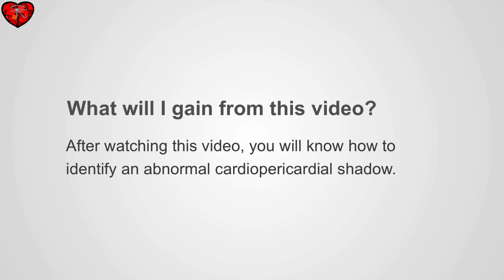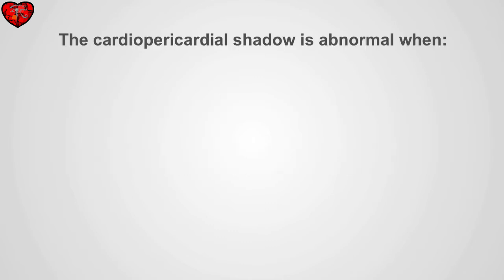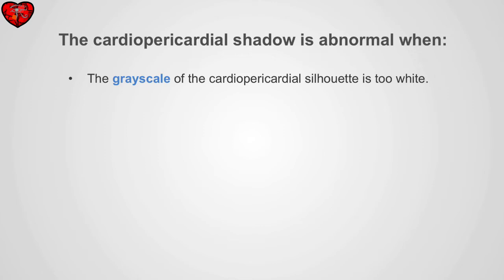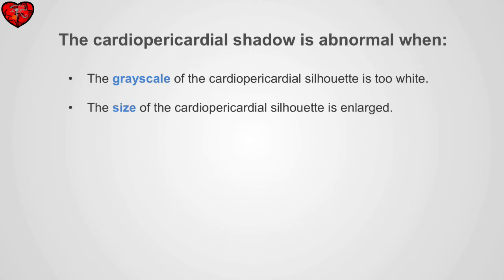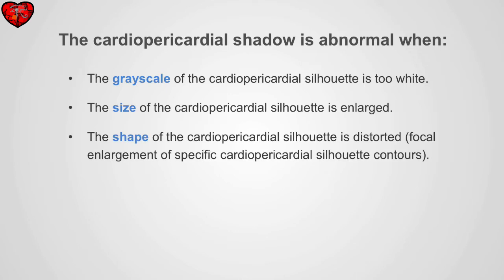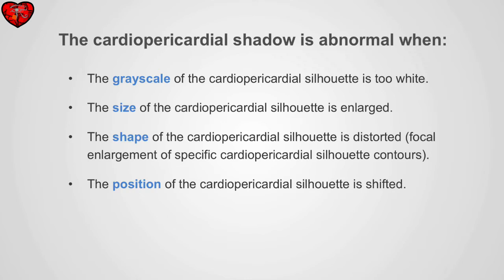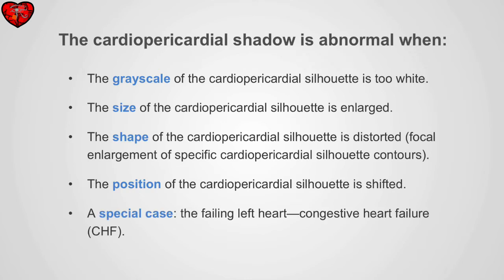After watching this video, you will know how to identify an abnormal cardiopericardial shadow. The cardiopericardial shadow is abnormal when the gray scale is too white, the size of the cardiopericardial silhouette is enlarged, the shape is distorted, the position is shifted, and in special situations when the heart is failing.